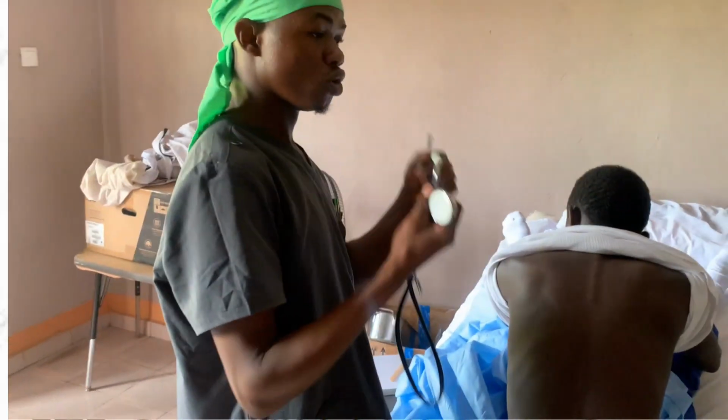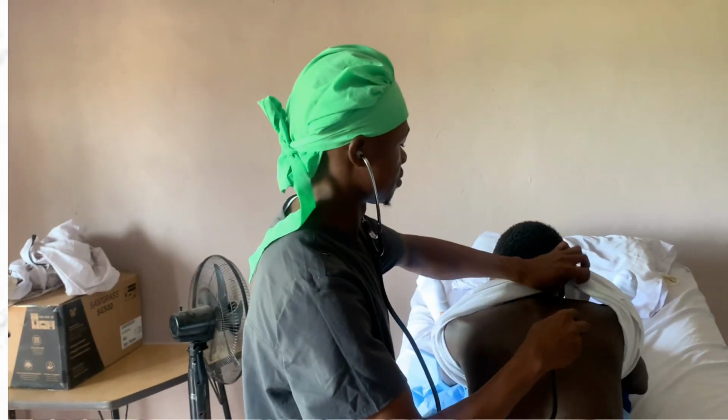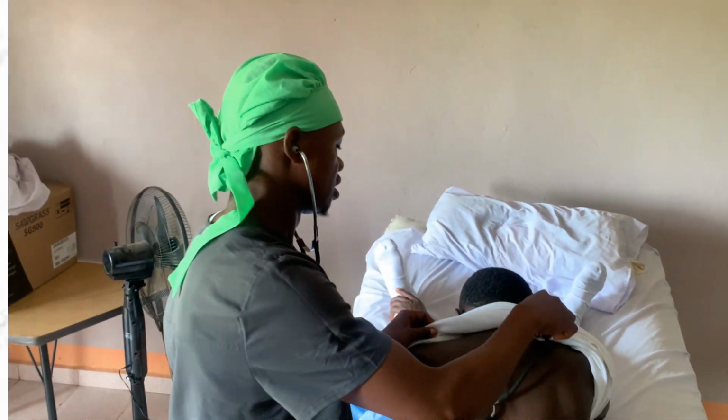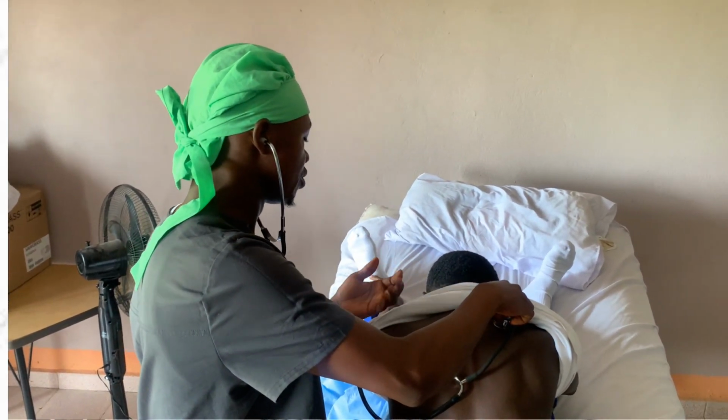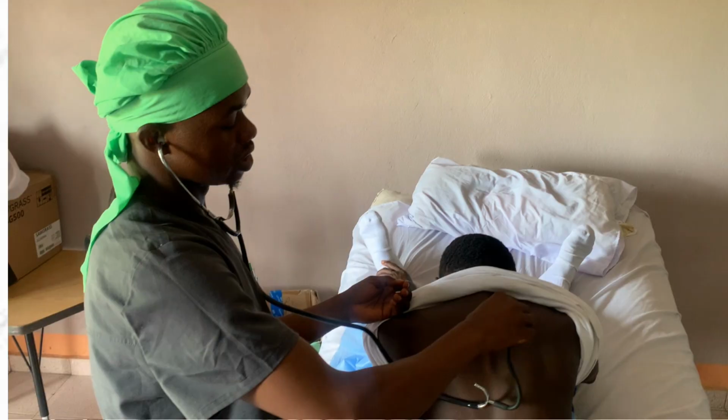So the last part of this is to auscultate the thorax, the posterior thorax. So let me quickly auscultate the posterior thorax to hear the lung sounds. There are abnormal lung sounds which we'll be looking for, like crackles and stridor, and these are the types of lung sounds we want to rule out. I start at the apex again. Be taking deep breaths as I auscultate. During this process, I will still tell the patient to take deep breaths. Mr. Amado, be taking deep breaths.